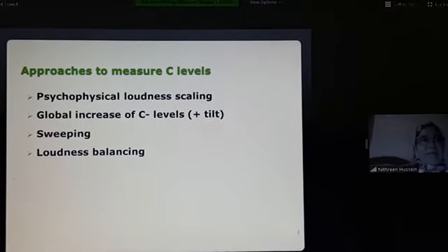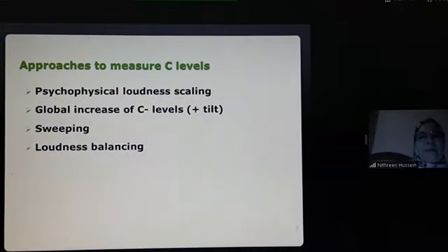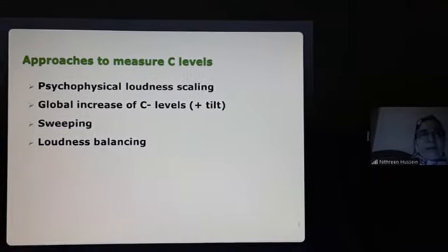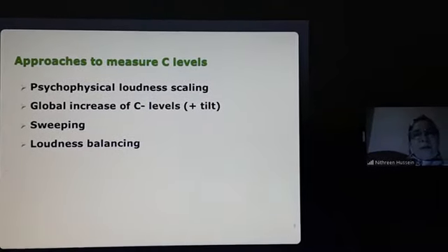Why? Because this will help the patient to identify the relationship between different parts of the speech segments so he can understand speech correctly. طبعا ده بيبقى صعب في الأطفال، بس ببتدي أعمله لما بيكبروا شوية ويبقوا cooperative.